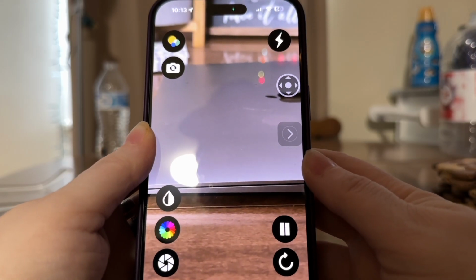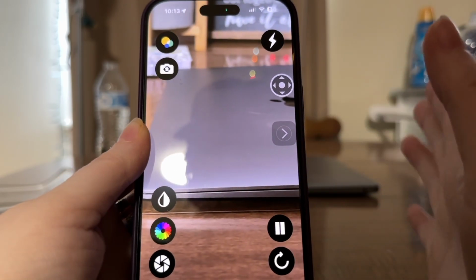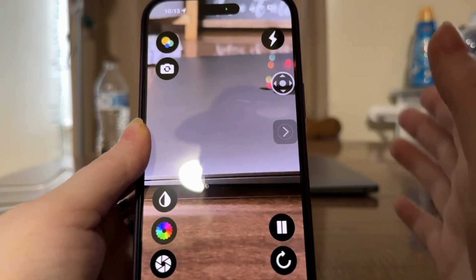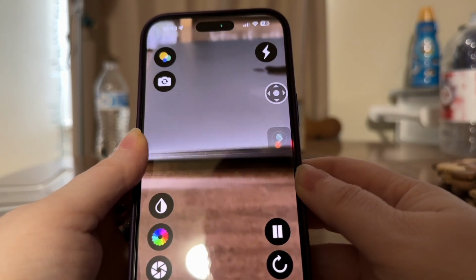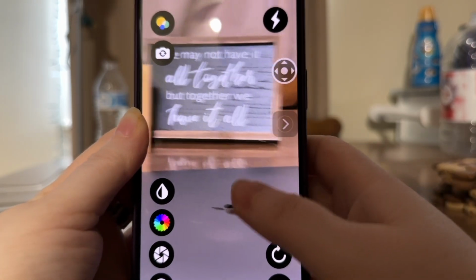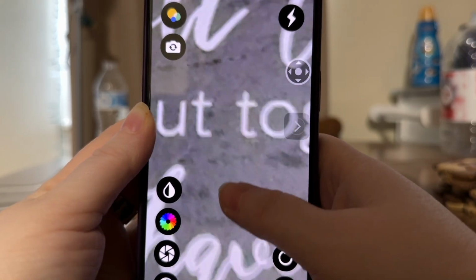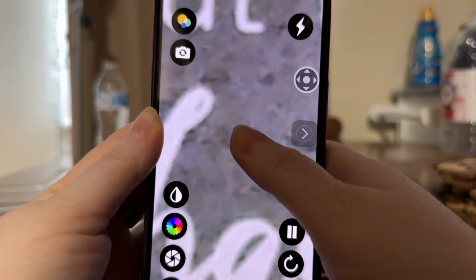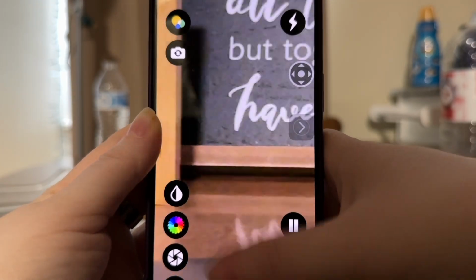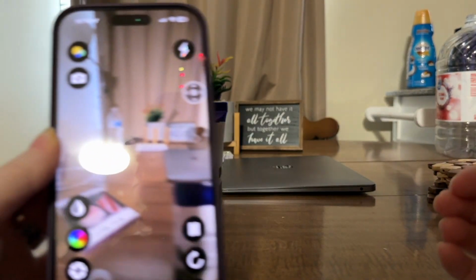So today I want to talk about an app that is called ReBokeh. I think that's how you say it. I'm not 100% sure. But it's a low vision aid, and it's a magnifier app kind of a thing. You can do your typical zoom up like this to zoom in and just really zoom in. Okay. That's across the table from me. You can see how far away that is.